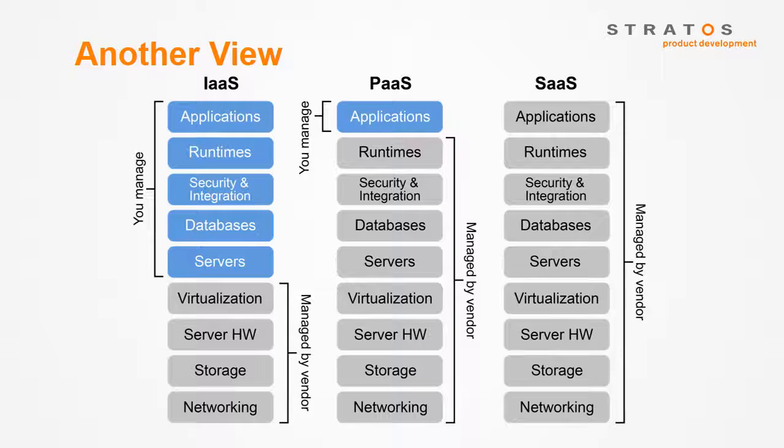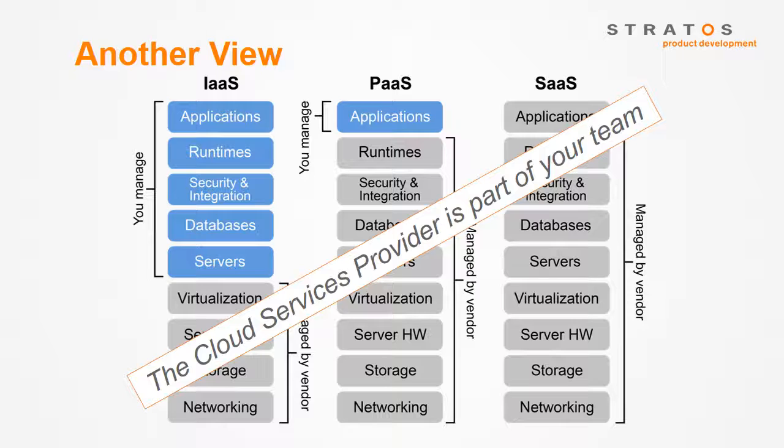To ensure that your system meets all of your requirements and your regulatory obligations, you will need to partner with your cloud services provider to understand the layers below your implementation. So, first thing to remember, your cloud services provider must be part of your team from the beginning.